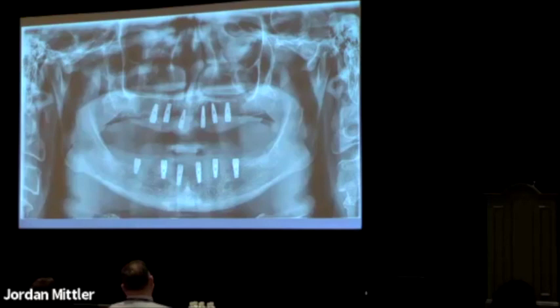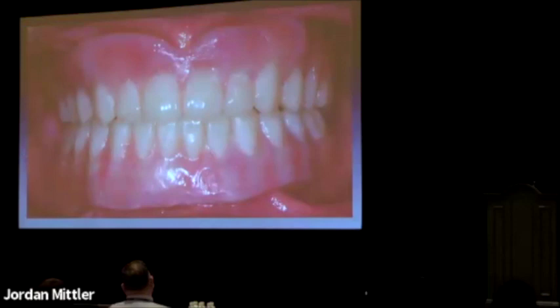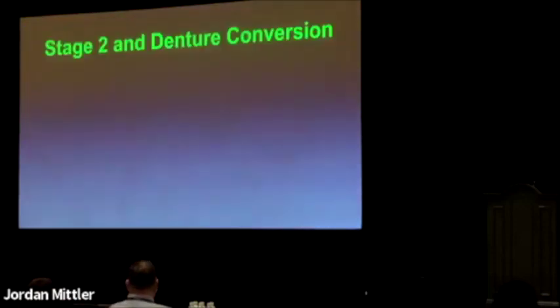Okay, immediate dentures in place. She wears these, she's happy. So now we get to stage 2 and denture conversion.